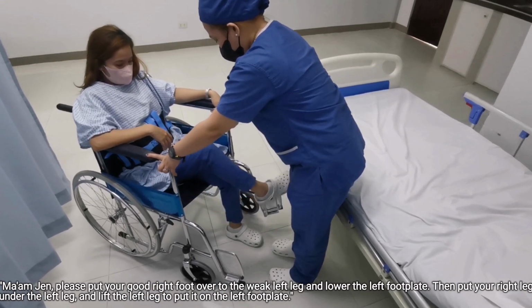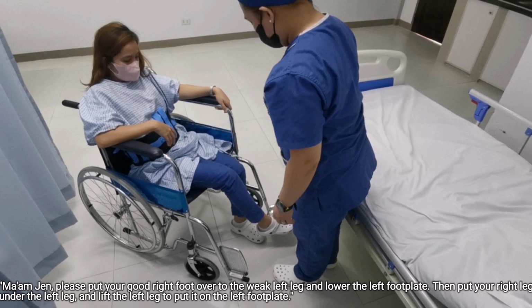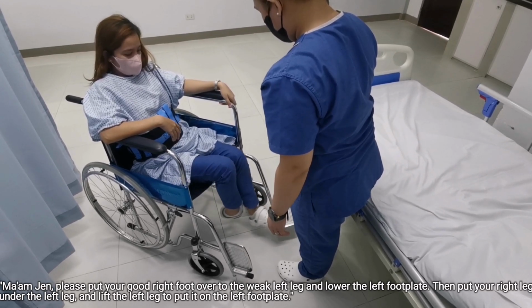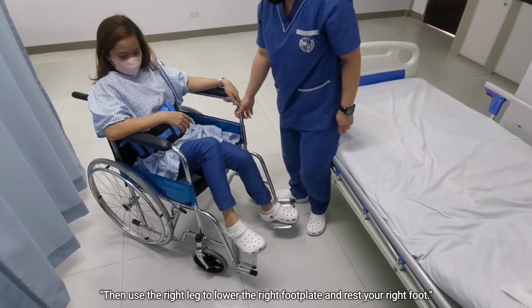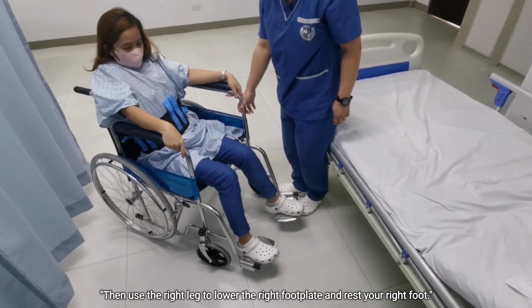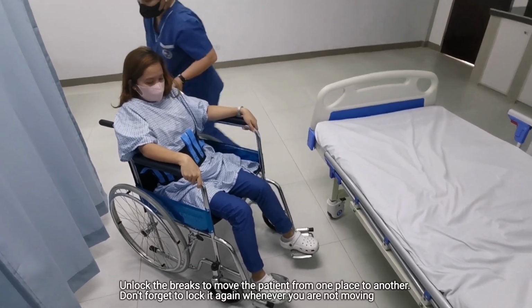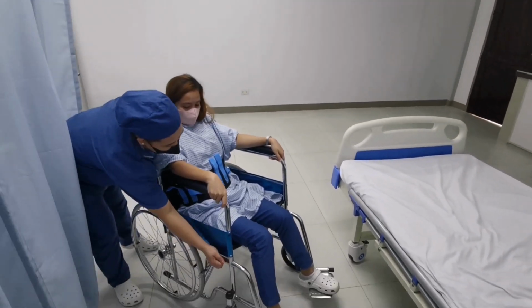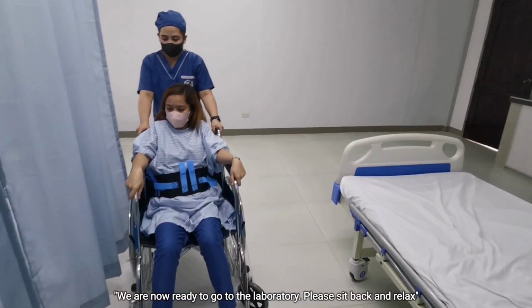Ma'am Jen, please put your good right foot over the weak left leg and lower the left foot plate. Then put your right leg under the left leg and lift the left leg to put it on the left foot plate. Then use the right leg to lower the right foot plate and rest your right foot. Unlock the brakes to move the patient from one place to another. Don't forget to lock it again whenever you are not moving. We are now ready to go to the laboratory. Please sit back and relax.